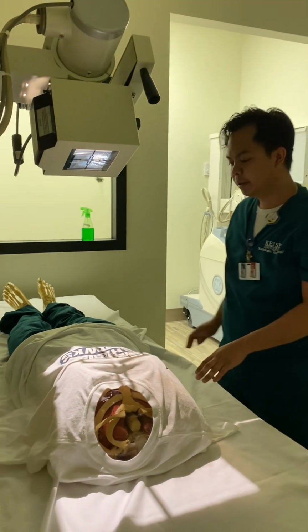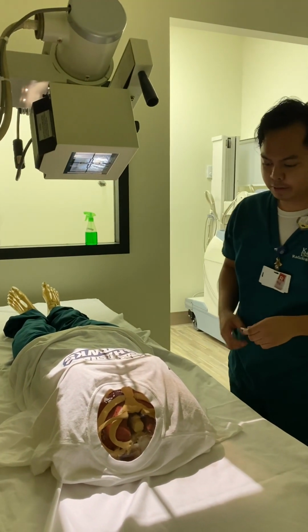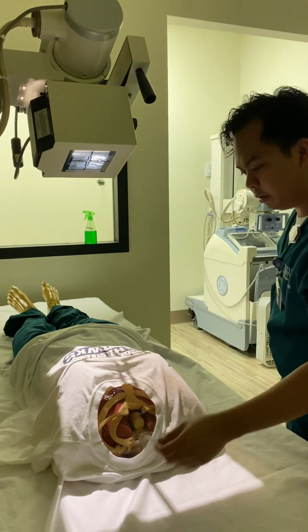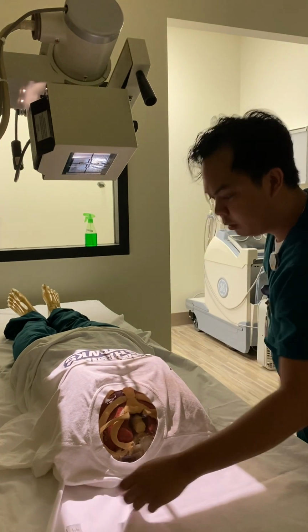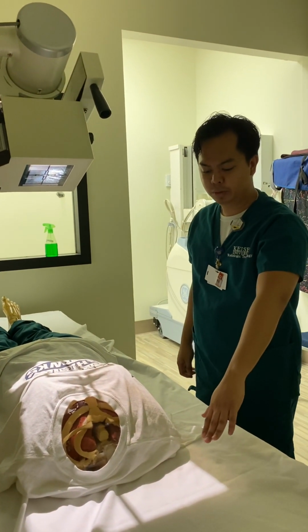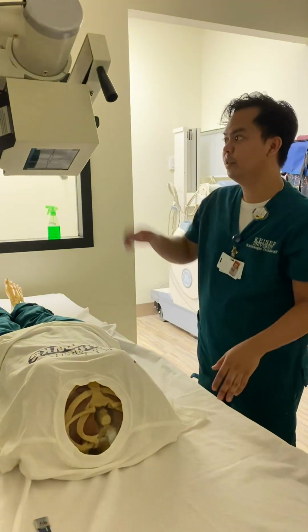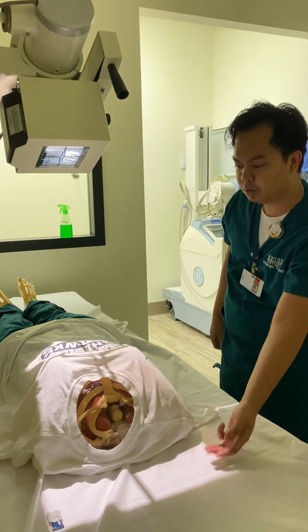Make sure it's midline again, and then have your markers to make sure it's on the left side. So they'll be right here. And then another note is you can check the collimation, the light field will be 2 inches above. So it's around 2 inches.